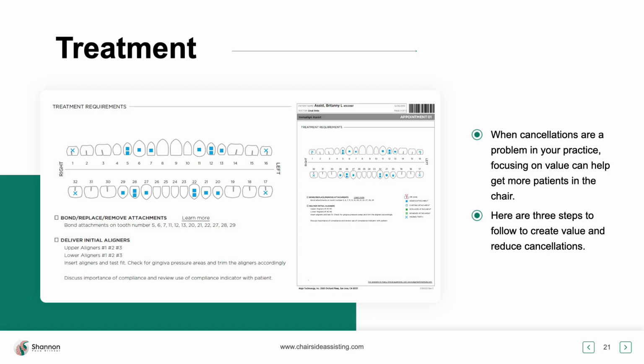But one of the beauties of having the treatment plan is it's going to tell us every step of the way, right? But again, knowing that those attachments are not square, they are, again, shapes.